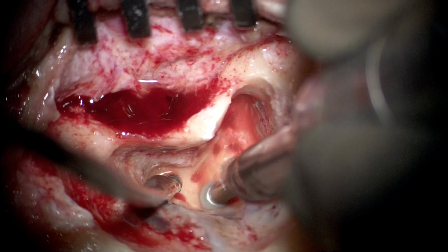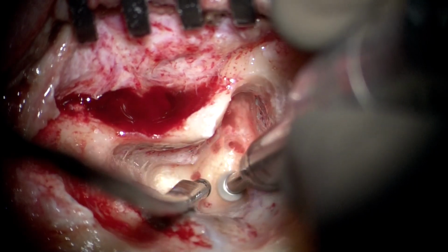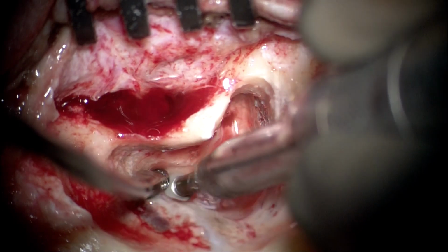We continue with our drilling to open all three canals. We have still not opened the vestibule, which lies anterior to all three semicircular canals.